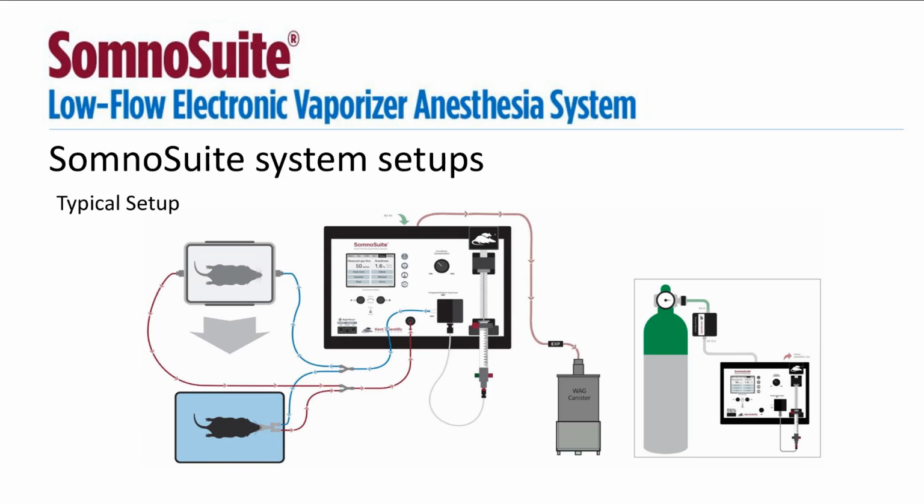So now I will take you through some various SomnoSuite system setups. Here in this diagram, you can see we have the SomnoSuite connected to one induction chamber and one face mask. Let me get my pen up real quick. Here we go.